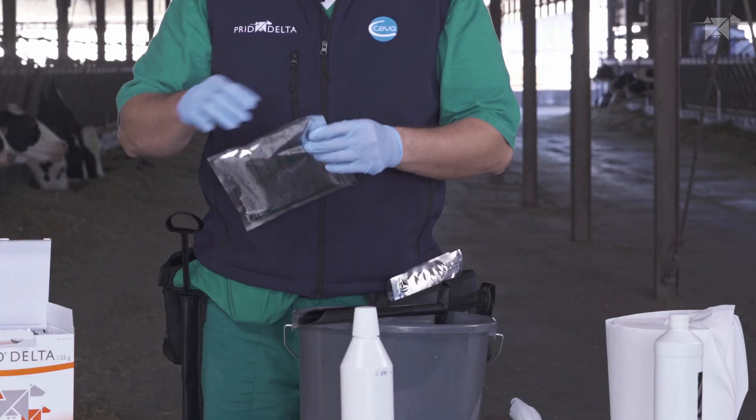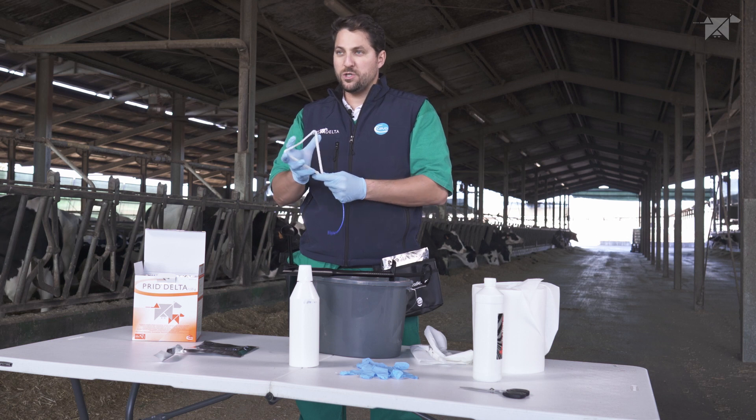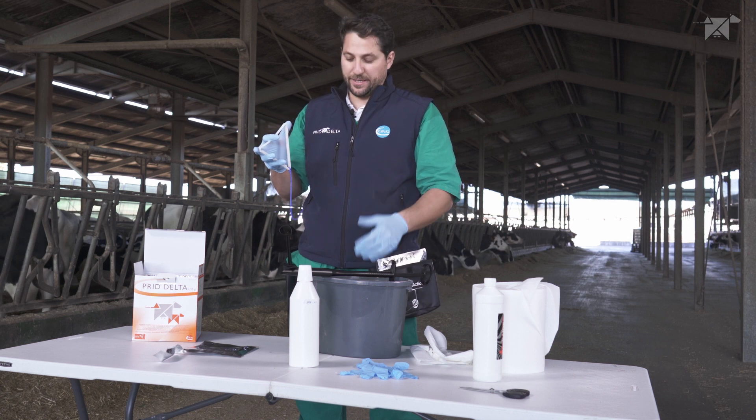Opening the aluminium bag, extract the device, and then we need to ensure the correct orientation of the device inside the applicator.